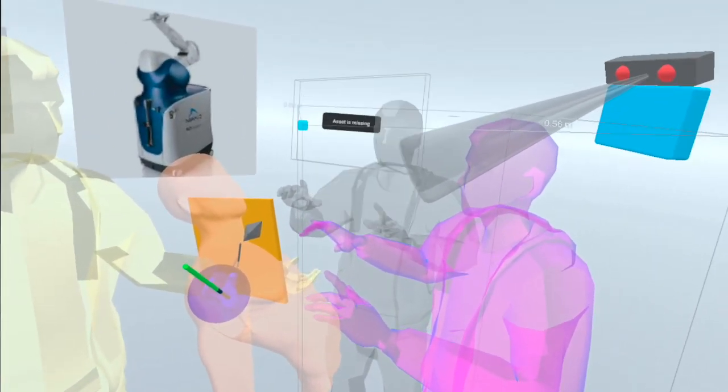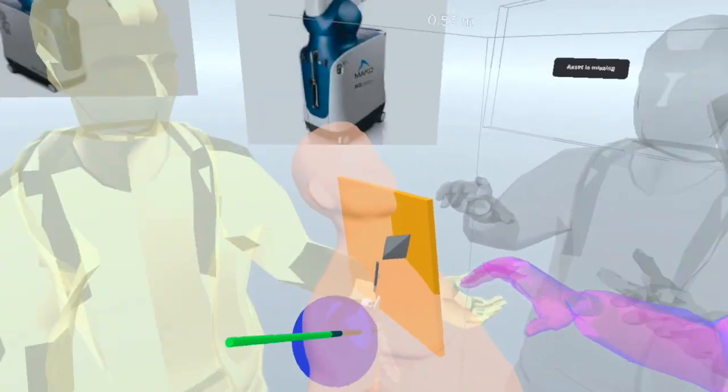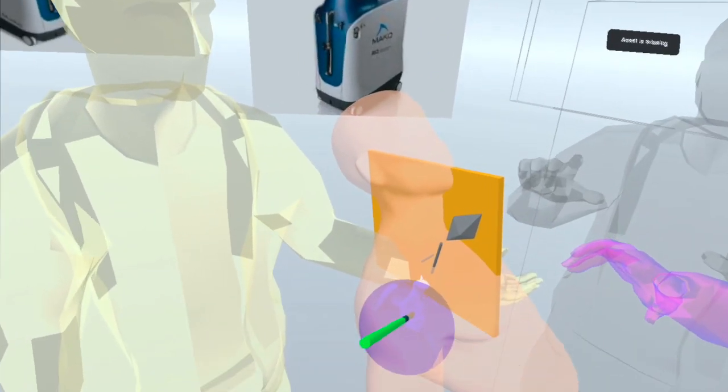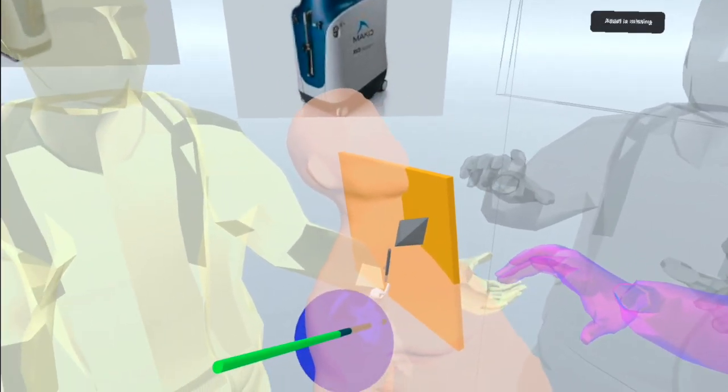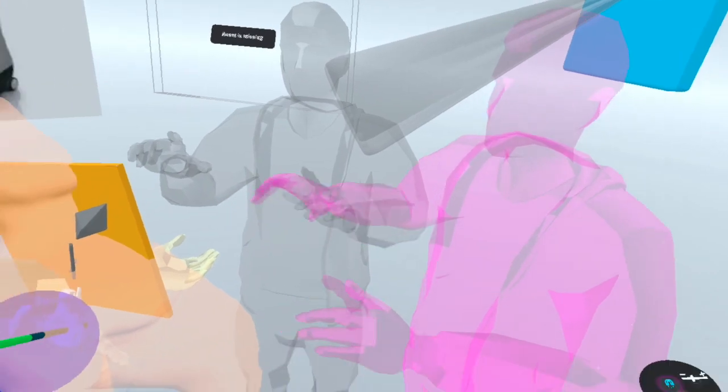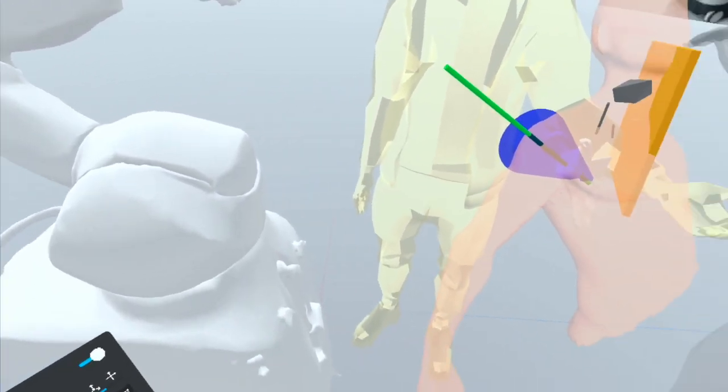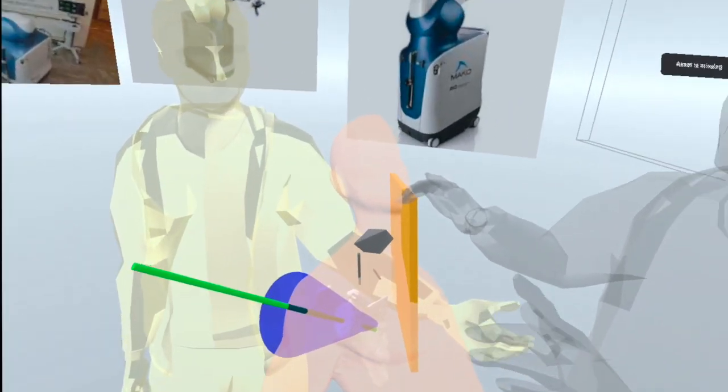There is not enough space to perform the surgery with the robot. It will be very hard for the robot to get in here. So with that, we need to remove this person right here.